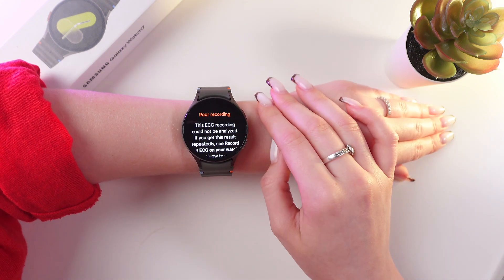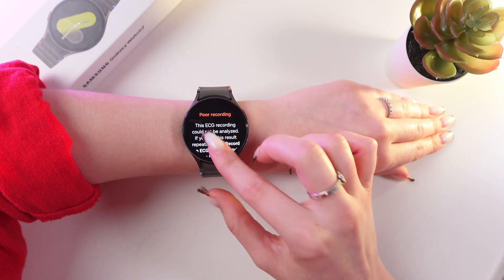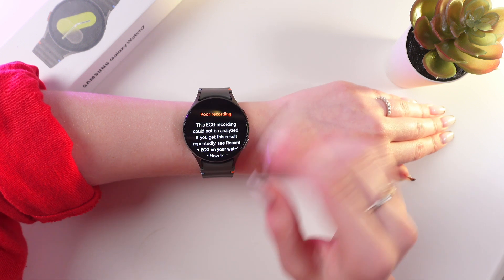Sometimes you can receive a result about poor recording, as I did. This can be due to the fact that you haven't worn your watch for at least 10 minutes before taking measurements.